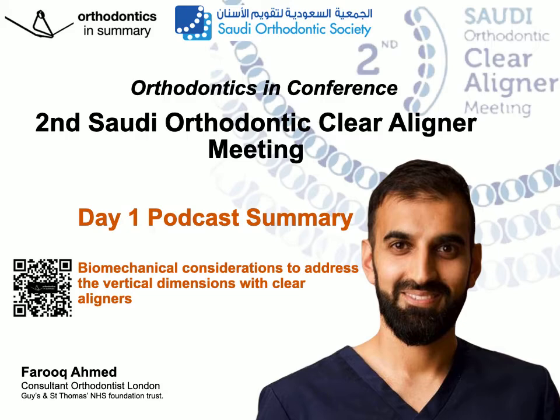Next was a discussion about rotations and how we need an intrusive force for them. And I think Maz explained this particularly well. So, when we have a rotation taking place on a tooth, we have both a labial force and a palatal force, creating the moment for rotation. However, that's not independent. It's not just the horizontal vector.